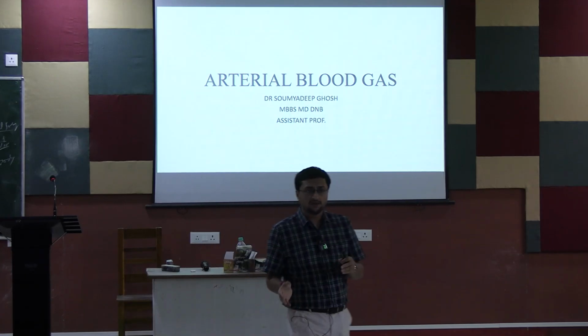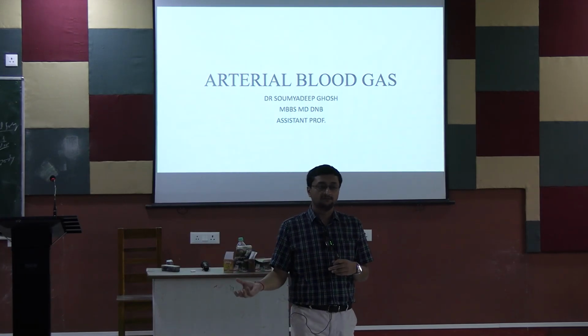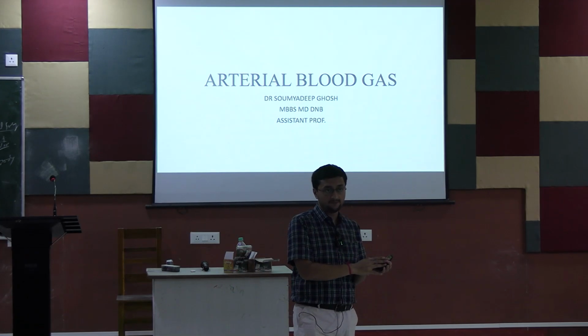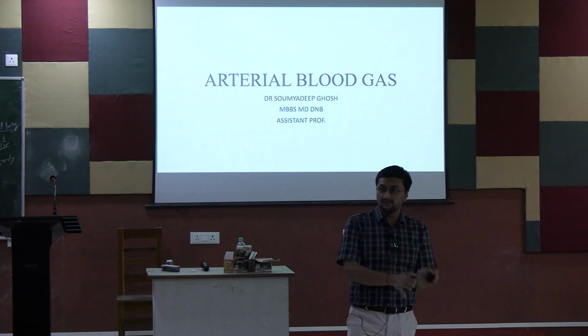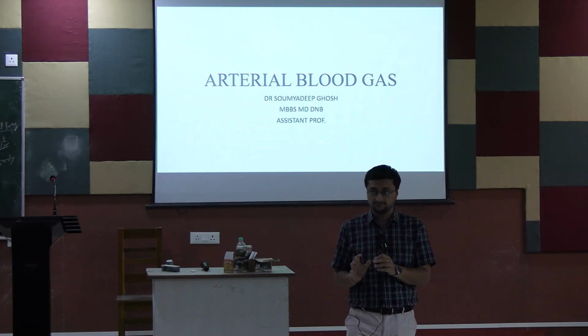Okay, so now if you wrongly collect the venous blood and you did a VBG, from the VBG, yes, you can also estimate ABG. The difference of carbon dioxide between VBG and ABG is around 3 to 5, right?